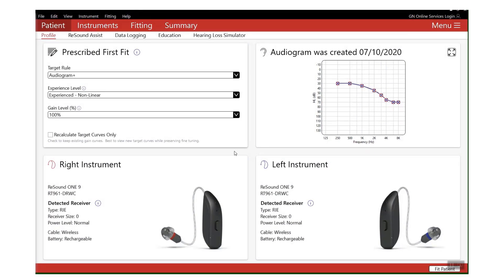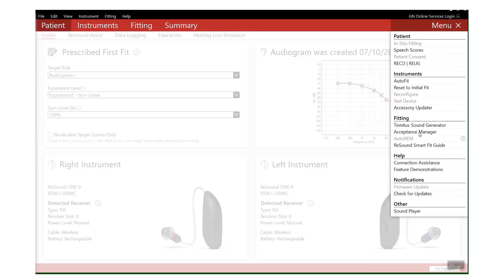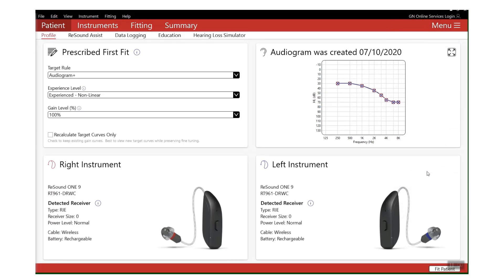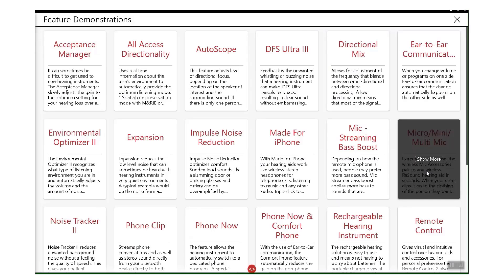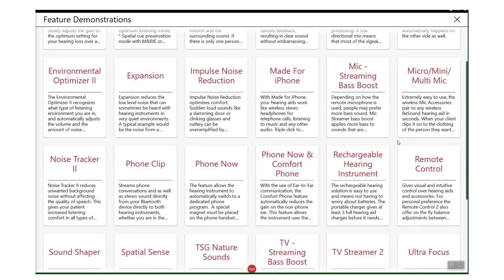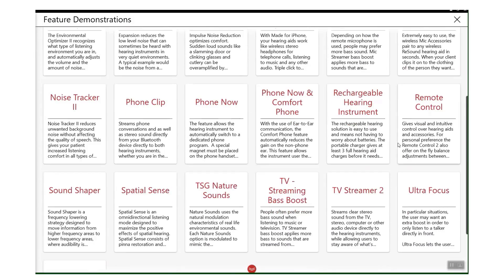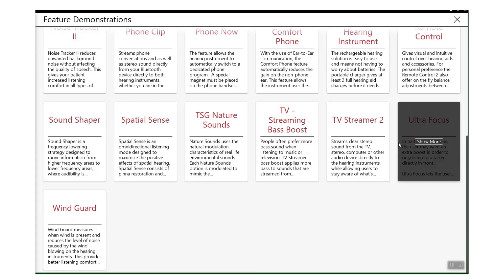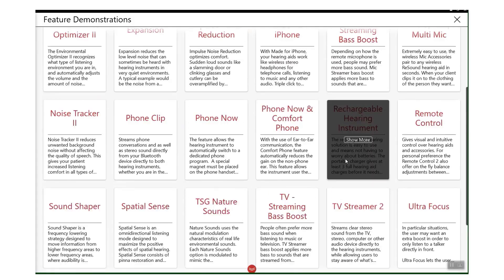Top tip number one: note your features. Sounds obvious, but with all the training in the world, things can still get forgotten or slip through the net. But don't worry - if you go into Menu and down to Feature Demonstrations, you will find a catalogue of every single feature with a brief explanation and video.